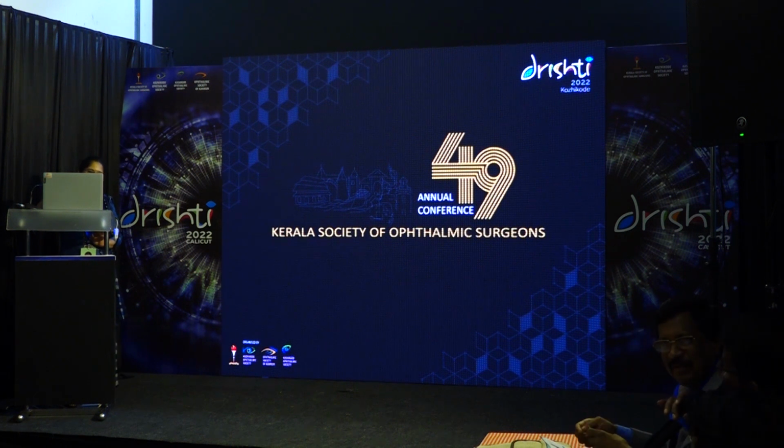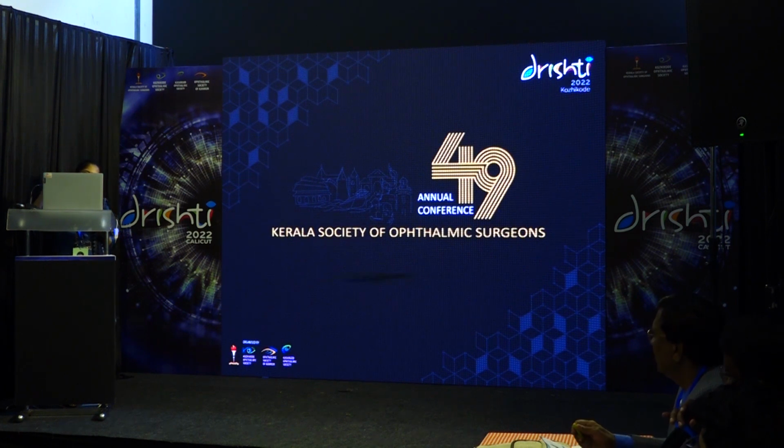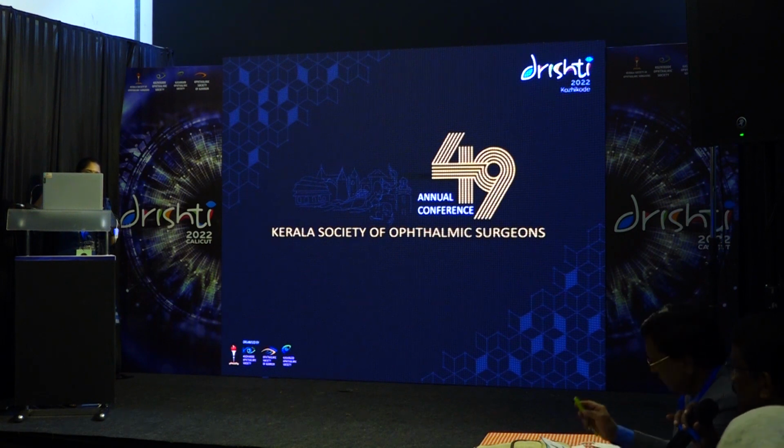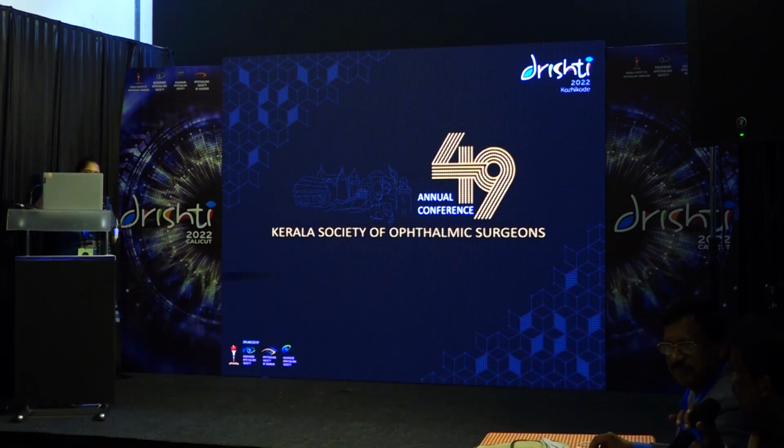Thank you, sir. How long after putting that stent will we remove it? So I remove it by 6 weeks. Literature says you can keep it 3 months to 6 months also. It's not usually required. By 6 weeks, healing is complete. There is no urgency in removing that. So you can remove it by 6 weeks.